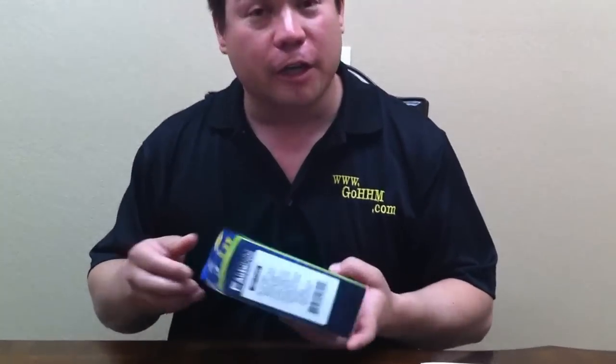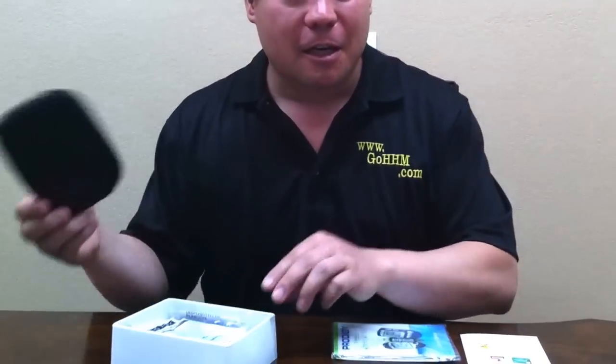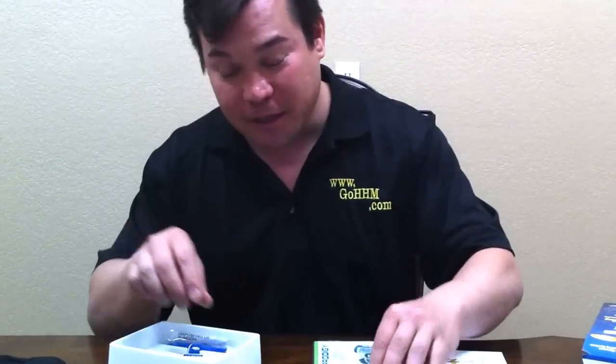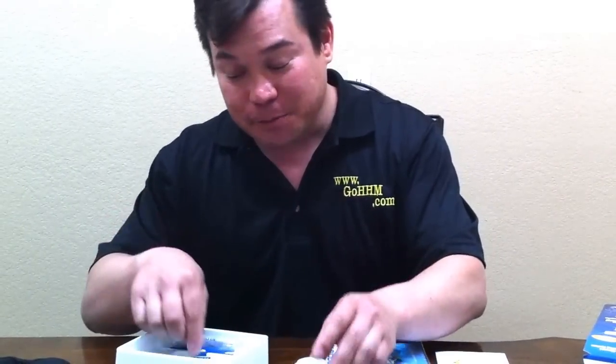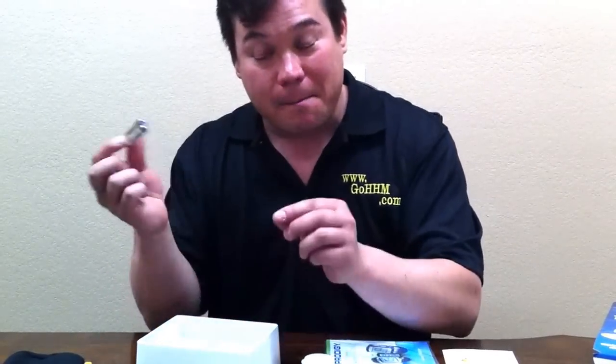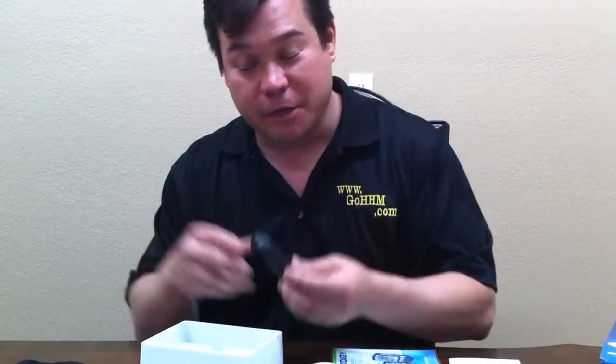When you first get your meter, you're going to get the entire kit. It includes, besides the meter, a bag to put your meter in, lancets — which are 10 sample lancets — 10 sample strips, calibration solution, a lancet injector, batteries, and the meter.